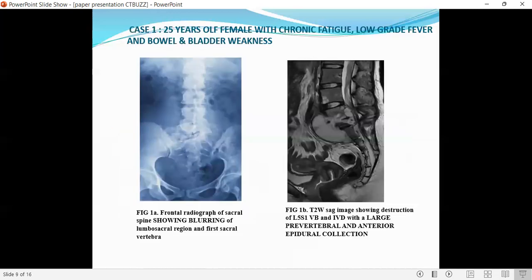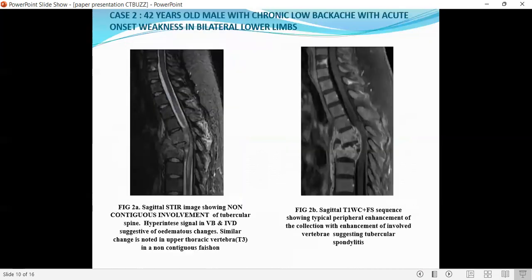Case 1: a 25-year-old female with chronic fatigue, low-grade fever, and bowel and bladder weakness. The first image is a frontal radiograph of the sacral spine showing blooding of the lumbosacral region. The second image is a T2-weighted sagittal image showing a large pre-vertebral and anterior epidural collection.